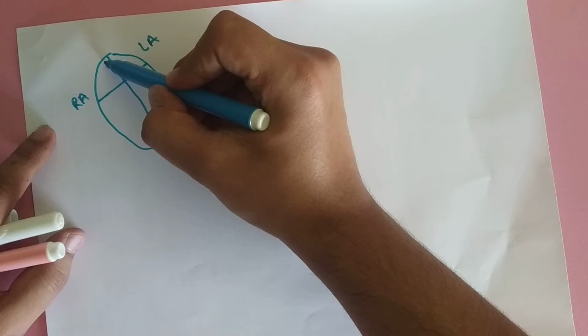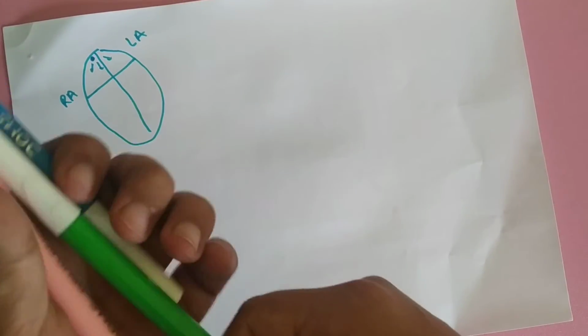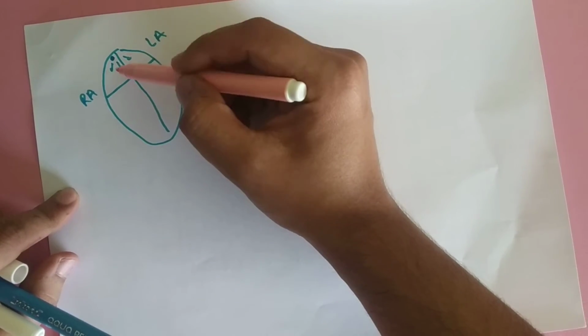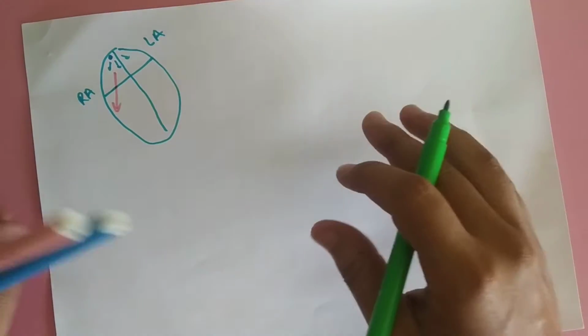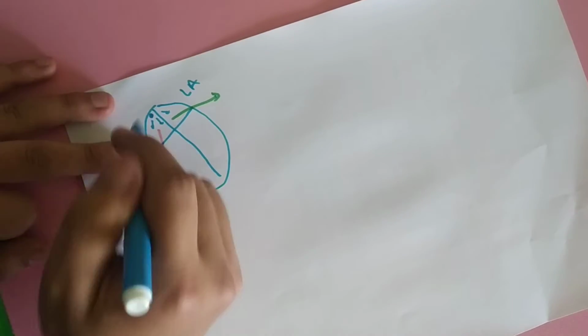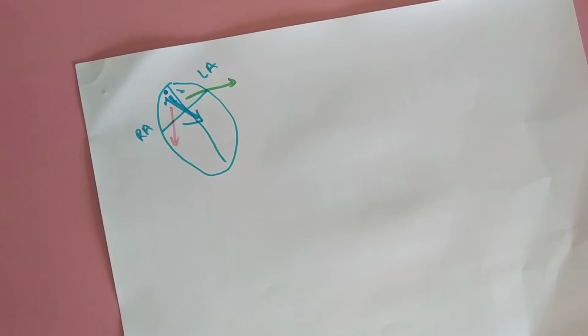So when the impulses travel from the SA node, they move throughout the atrium. So when we take the resultant vector, suppose the resultant vector of right atrial depolarization is in this direction. Similarly, the depolarization vector of left atrial contraction will be in this direction, and when you take the resultant vector, then the resultant atrial depolarization vector will be in this direction. So up to here I hope it is okay.